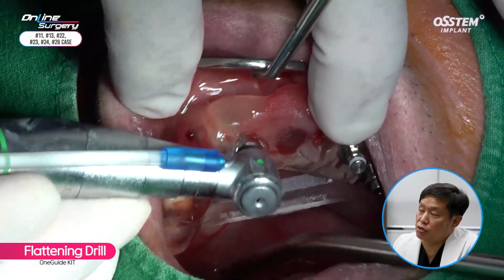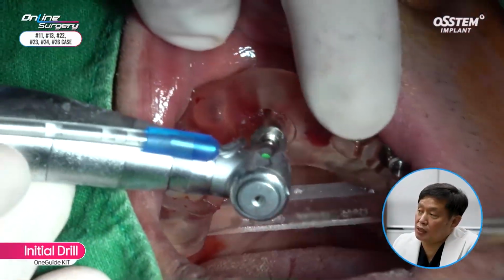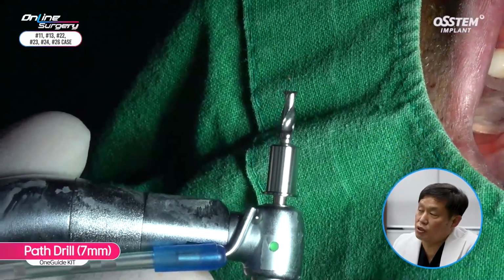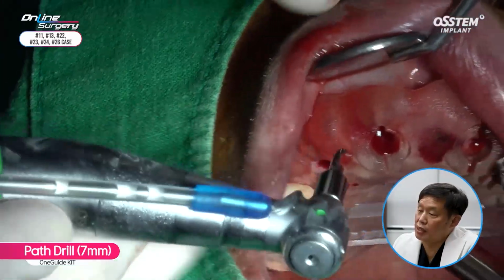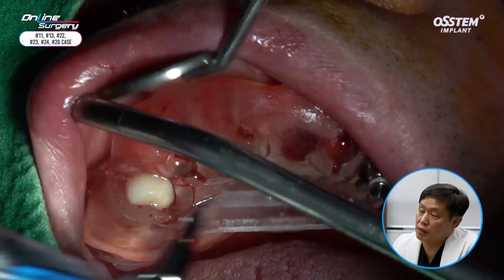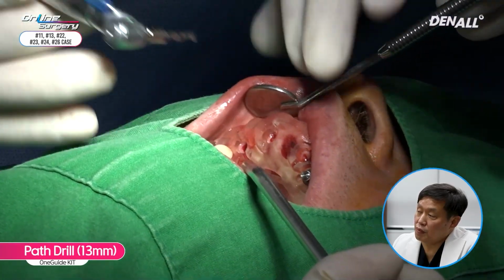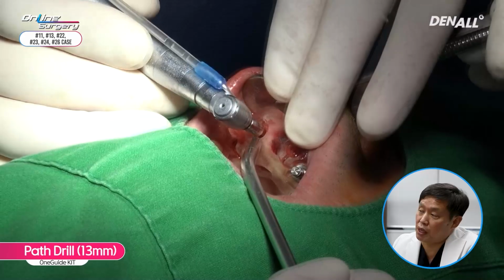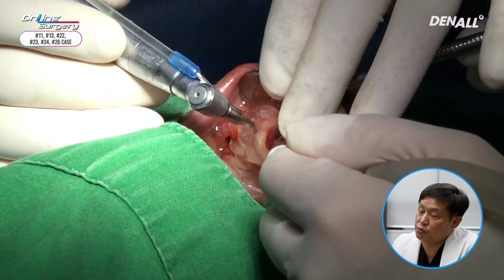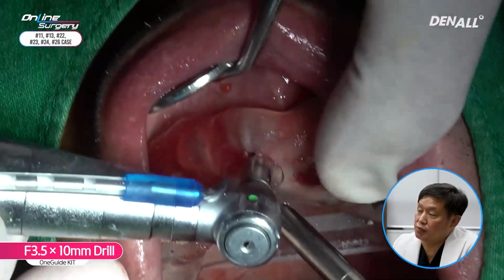The template was checked, and then moving on to number 11, the flattening drill was done, followed by the initial drill. Because the tooth fell out, I think initial drilling would suffice. In order to prevent any deviation on the palatal side, a 7 mm path drill was used to prevent slipping. Because the palatal side was a bit hard, a 13 mm path drill was used. The plan was to place a 10 mm implant, and the path drill was used up to 11.5 mm. Next is the 3.5 by 10 mm OneGuide drill. Drilling was done.